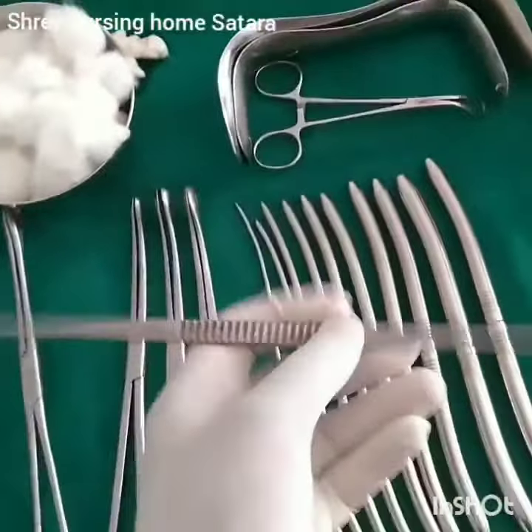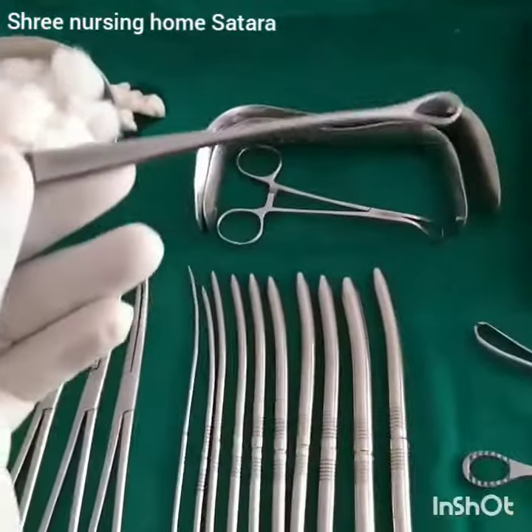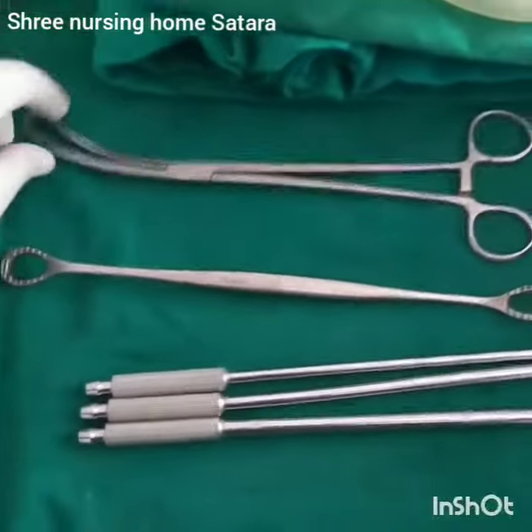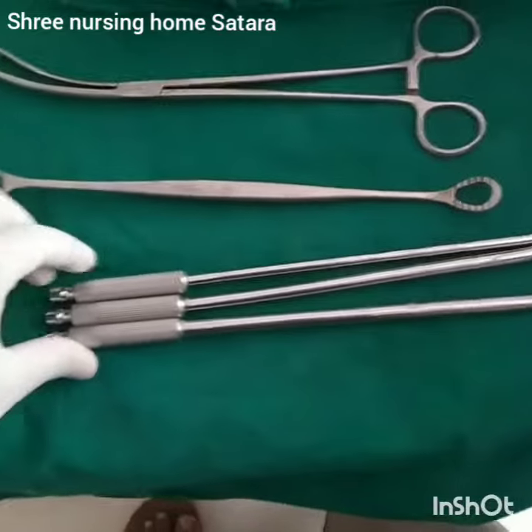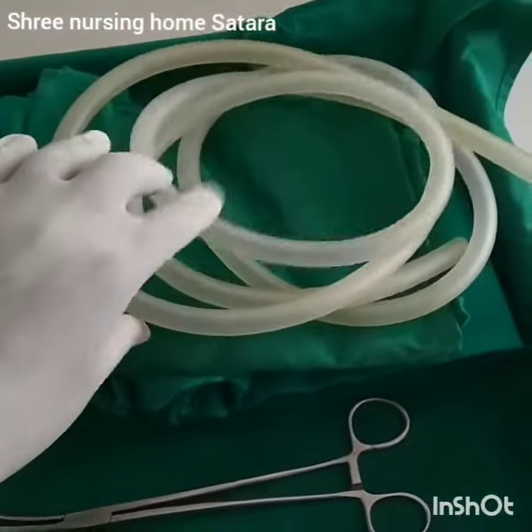This is a curette, which one end is a sharp end and the next end is a blunt end. This is vulsellum, this is AV retractor — anterior vaginal wall retractor. These are metallic suction cannulas, sheets, and suction tubes.